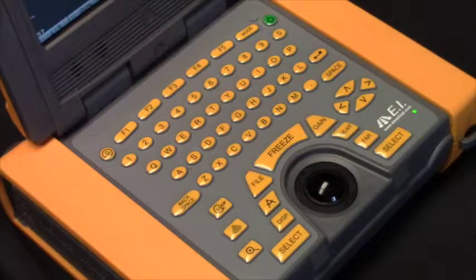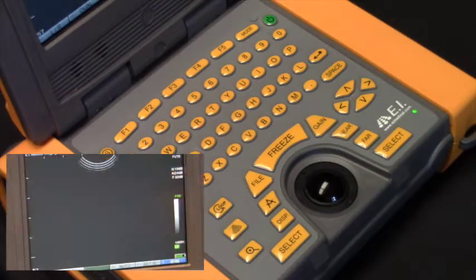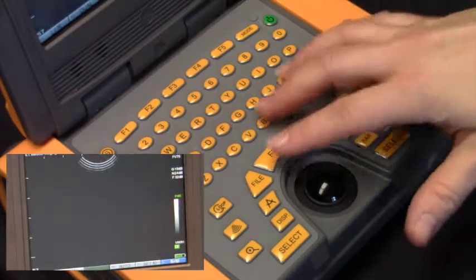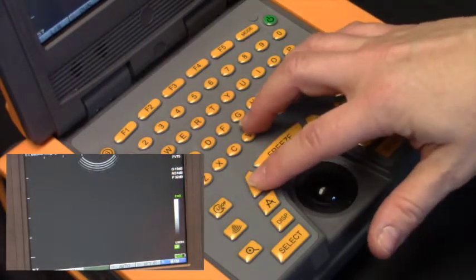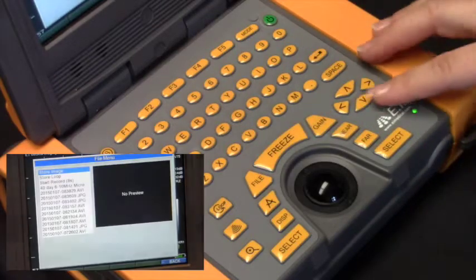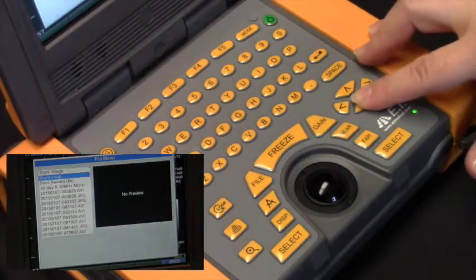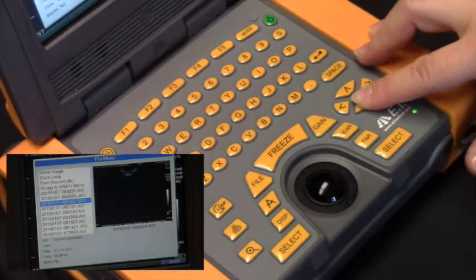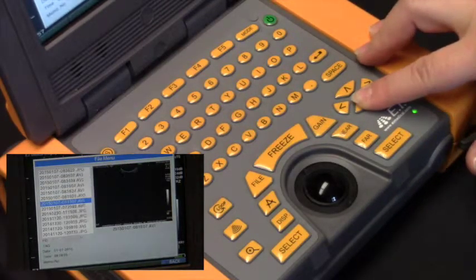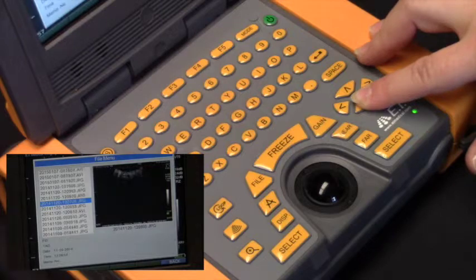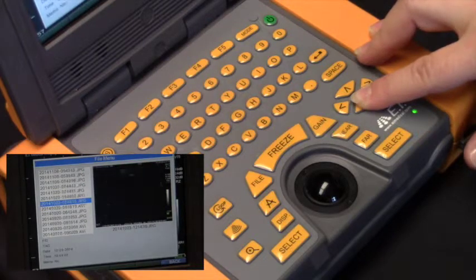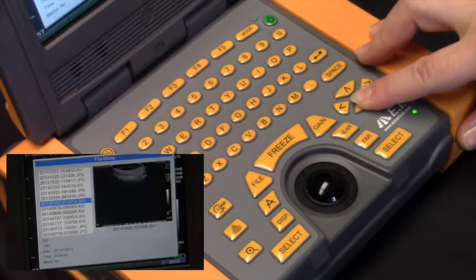To recall an image that's been previously stored on the IBEX ultrasound, select the file key. All of the previously stored images will be listed under the file menu, first in chronological order and then in alphabetical order.